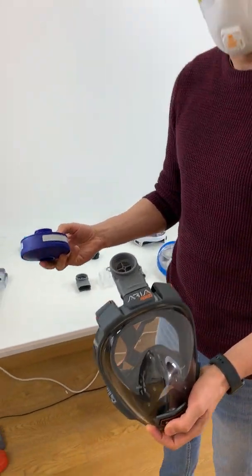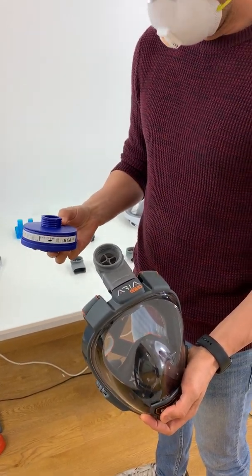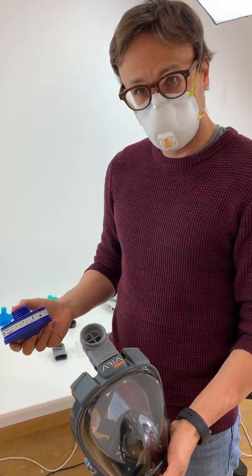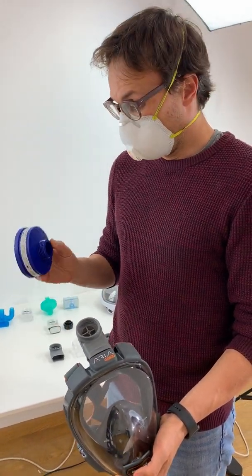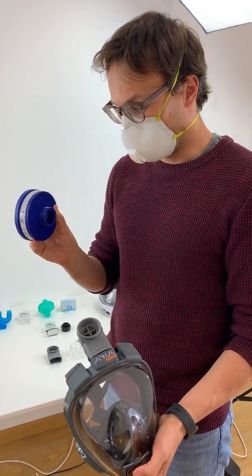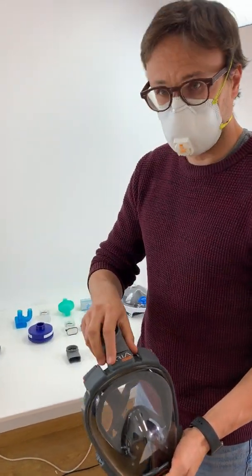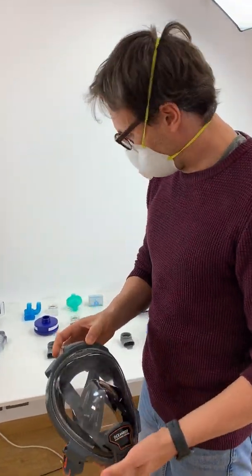There are plenty of filters out there. This is just one brand — our brand. There are plenty of P3 filters from other brands as well. There are also Bayonet filters, for example 3M, that have adapters to convert those filters into 40 millimeter standard threading filters. You can find these on the internet. Again, there's a shortage of everything, so we understand it might not be easy to find at the moment.